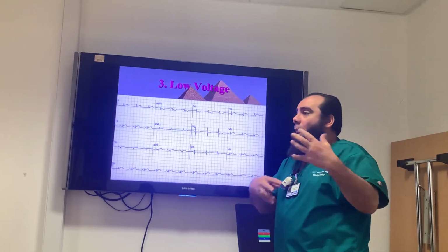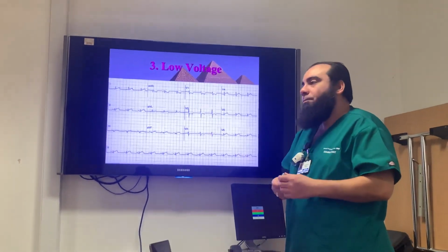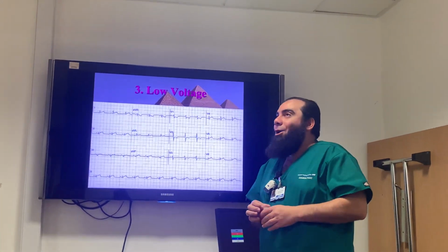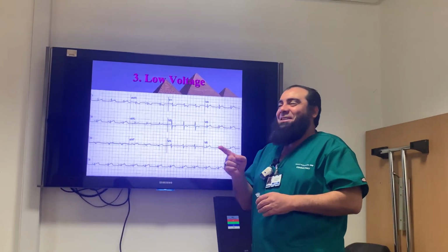Emphysema, and so on. So if you've got a developing pericardial effusion, you should see the amplitudes get lower and lower as the pericardial effusion gets bigger. Okay, tricky question. I think we have discussed that before.